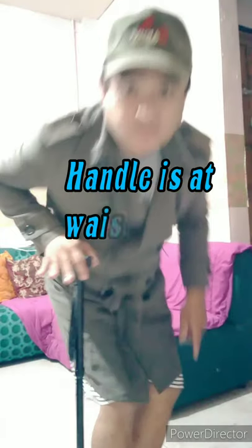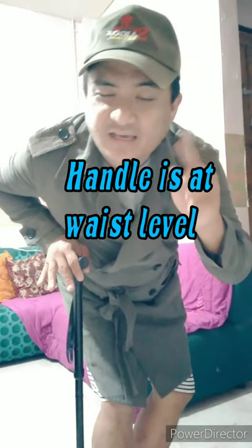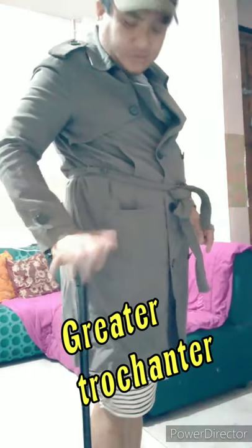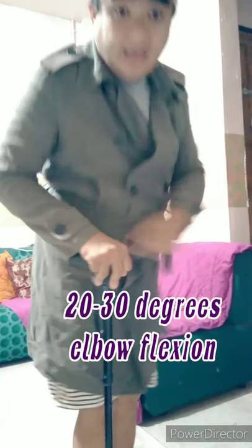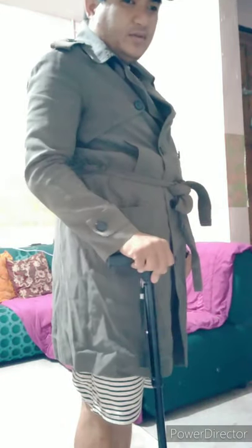For measurements, the handle should be at the waist level. To be more technical, it should be at the level of the greater trochanter. Also, your elbow flexion should be 20 to 30 degrees — not 45 degrees, but 20 to 30 degrees. Then the patient holds the device on the strong side.